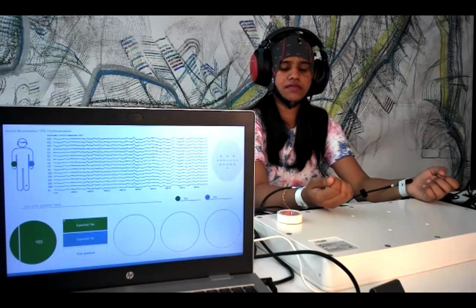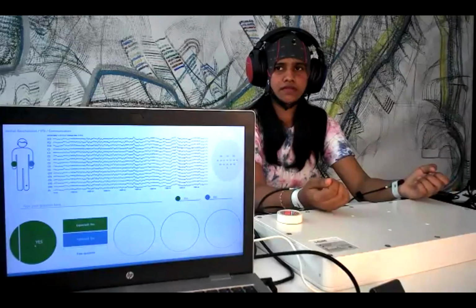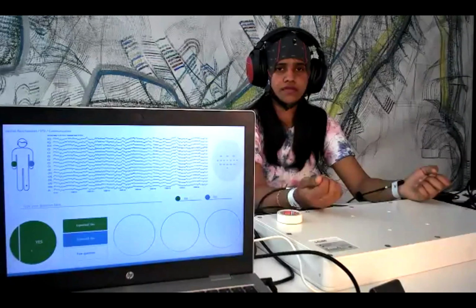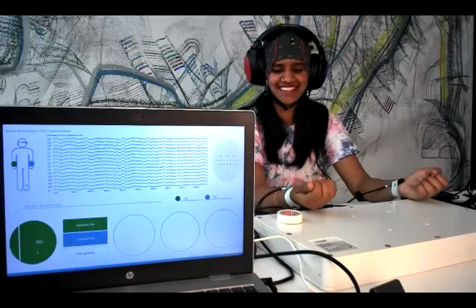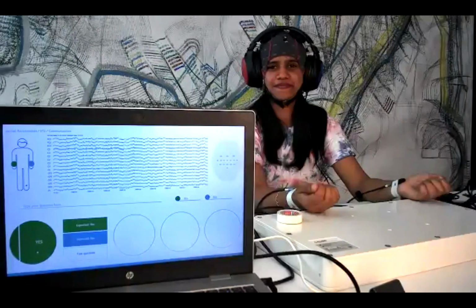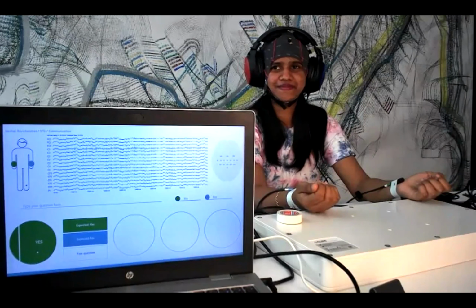Perfect. So you can see the results here. That's a yes. You see the count actually changes when each trial is classified correctly. So eventually the final decision is yes, which means partially you do like the mindBEAGLE. Thank you. I think I can still try maybe one more question.